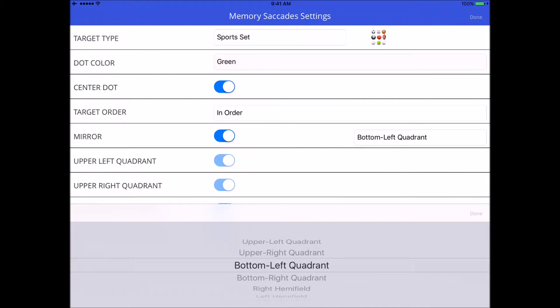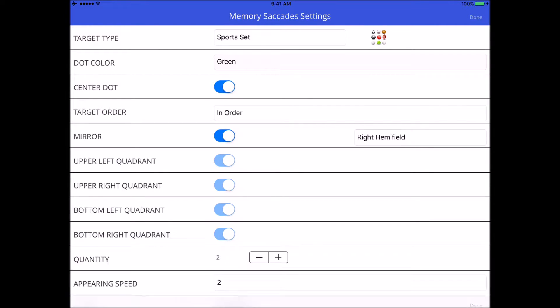If I pick the upper right quadrant, I would have to remember where the targets appeared in that quadrant — look at each target one at a time, then back to the center fixation dot, next target, center fixation dot — and once they disappear, reproduce exactly where they appeared, and then also reproduce in the mirror location in all other quadrants. You can also do this with hemifields.